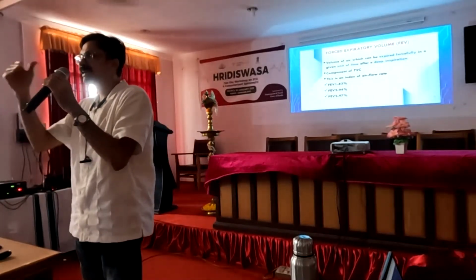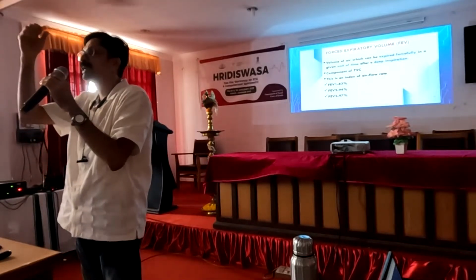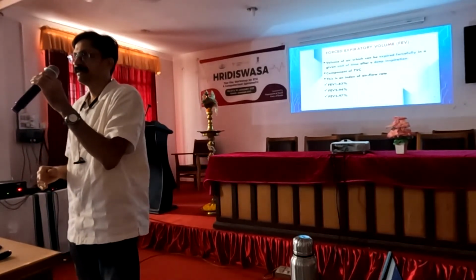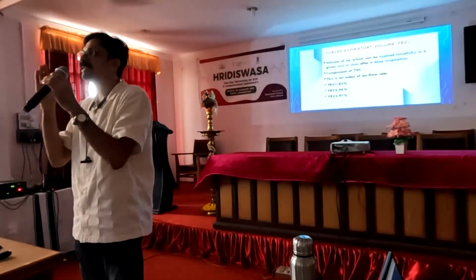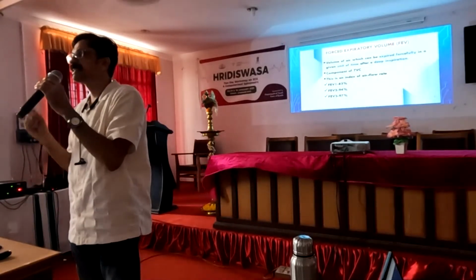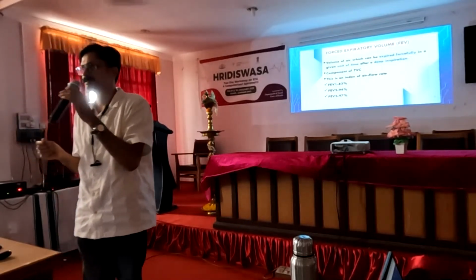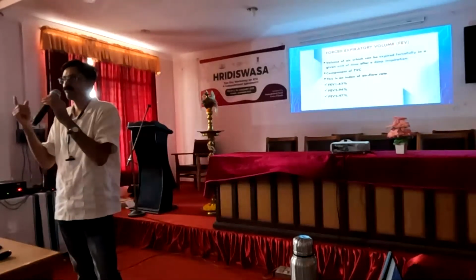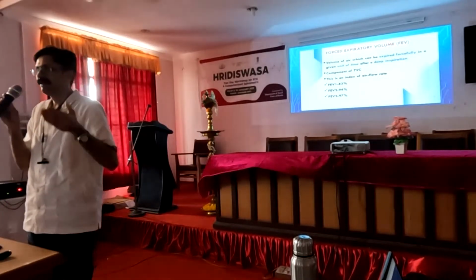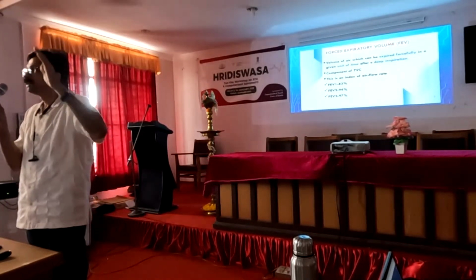So we are assessing how much volume of air is expelled at the end of the first second. That is FEV1. It is very, very important for differentiating between obstructive and restrictive lung diseases. FEV1 and FVC, forced vital capacity. Clear? FEV2 means at the end of 2 seconds.